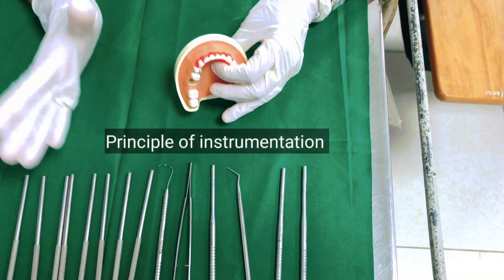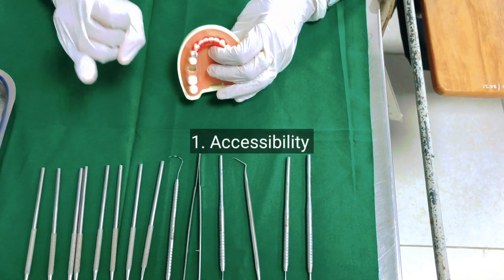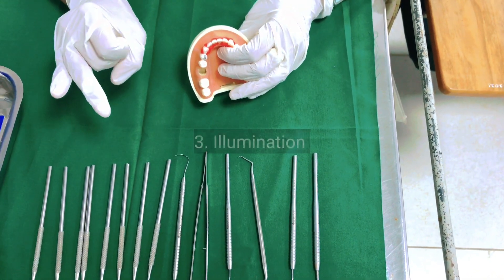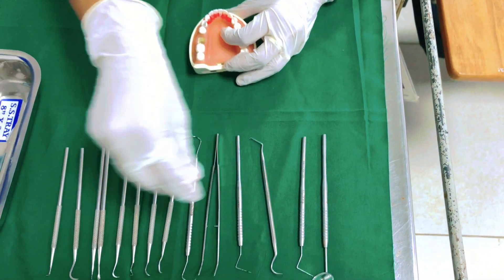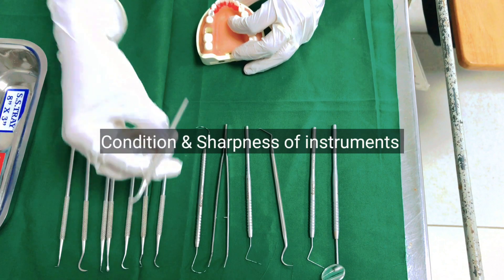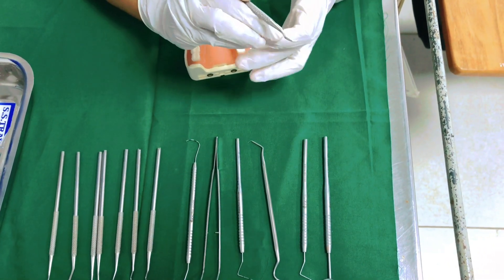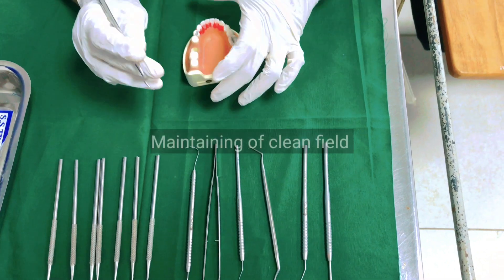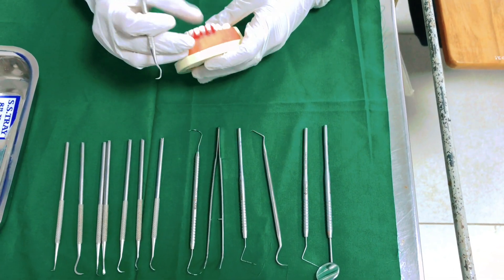The principles of instrumentation are as follows: number one, accessibility, visibility, and illumination; then comes retraction; and the next point is condition and sharpness of the instrument. After maintaining a clean field, you have to start the instrumentation.